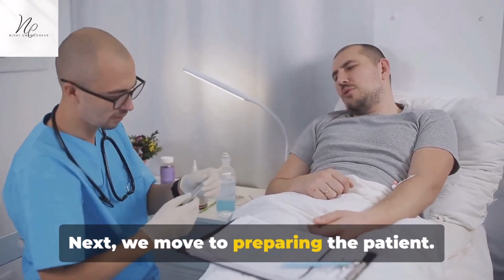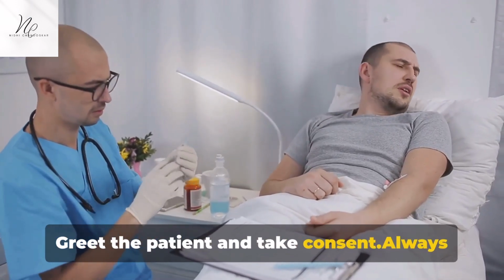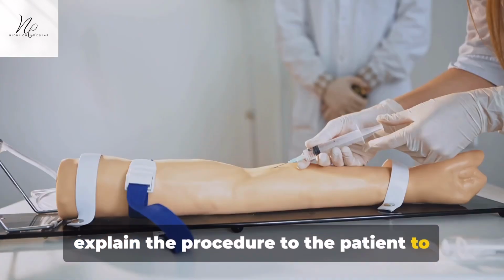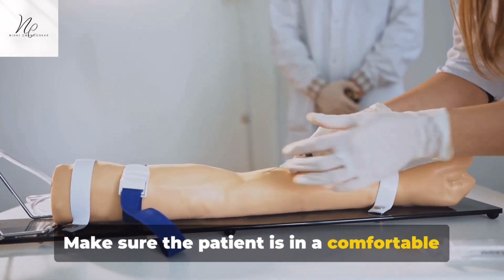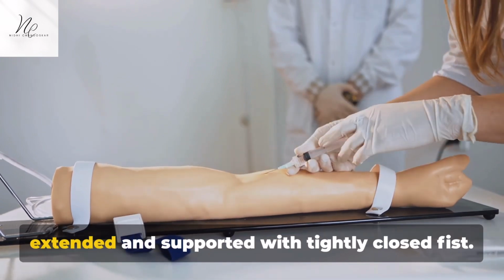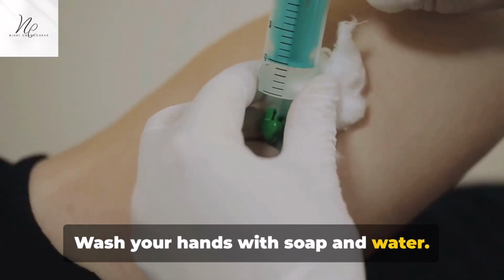Next, we move to preparing the patient. Greet the patient and take consent. Always explain the procedure to the patient to alleviate any fears they may have. Make sure the patient is in a comfortable position, typically with their arm extended and supported with a tightly closed fist. Wash your hands with soap and water.